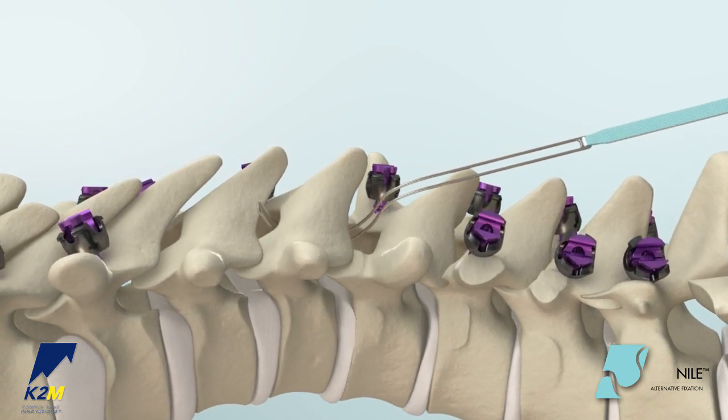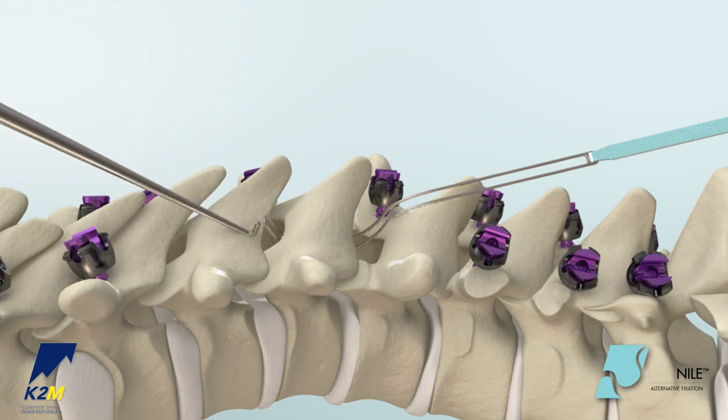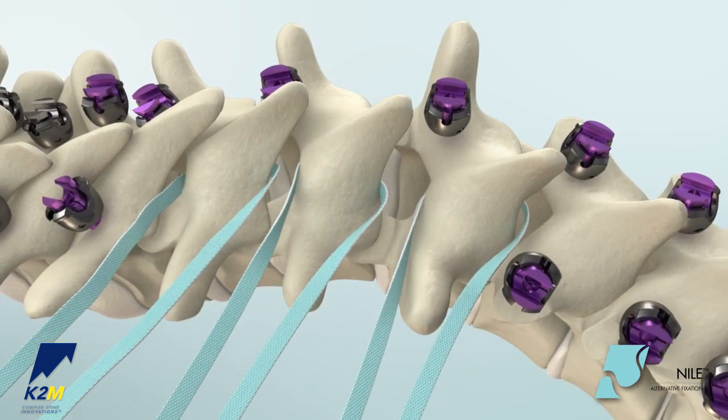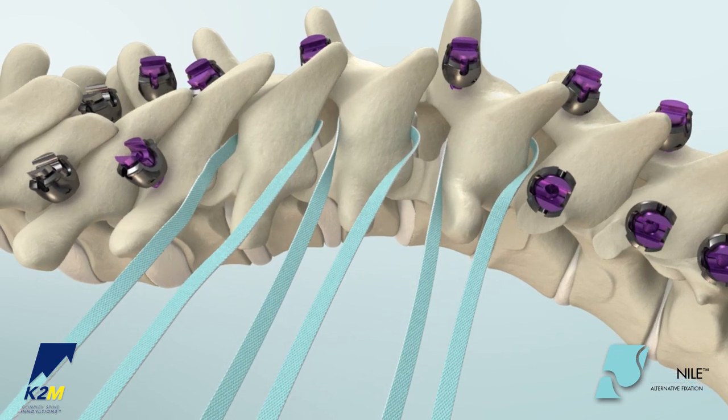When the tip of the leader is visible on the other side, grab the tip with leader forceps or insert the leader hook into the hoop of the leader tip for a more stable passage of the band. Repeat the steps if additional bands are needed. The bands may be laid outside of the wound until ready to attach to the clamp.